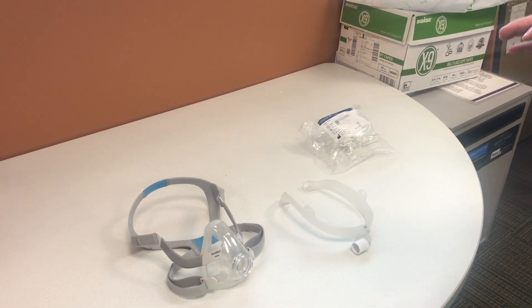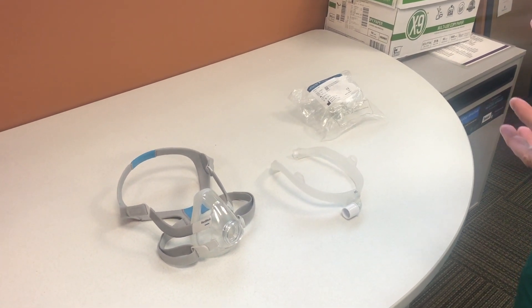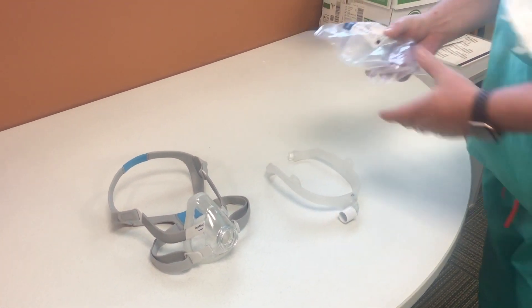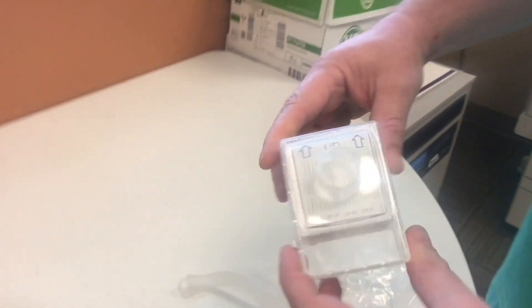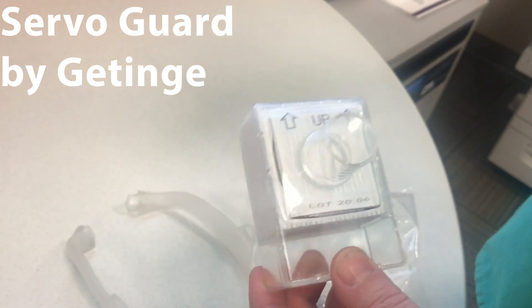Just in case we got into a bind and we needed some type of N95 or better protection — I was in clinic and I came across some ideas. I'm going to show you how to build your own N95 mask, actually better than that, because apparently these servo inline ventilator filters are N100 and they're specifically designed for viruses.